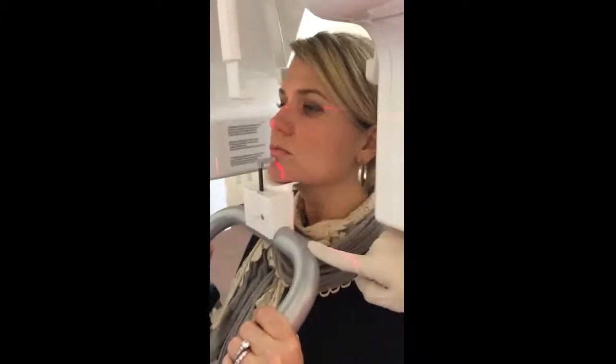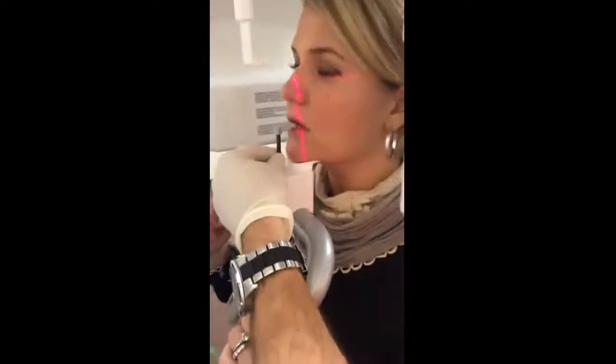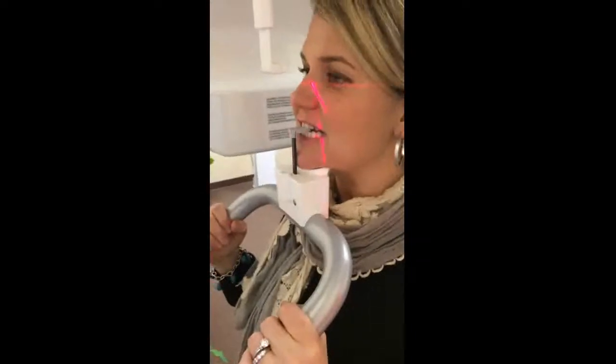Place your hand on the patient's back. Ask them to pull into the unit so that you get the collarbones close to this bar. Okay. If the chin rest is a little high, we'll simply bring it down, lift the bite stick, ask the patient to come forward, and close lightly on the stick. Their teeth will fall into the grooves.